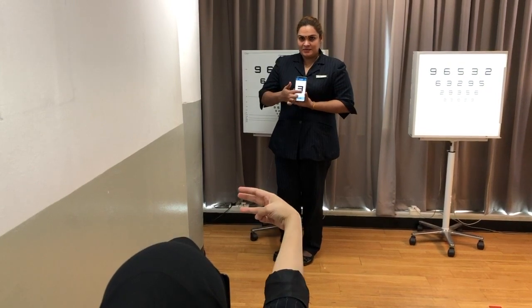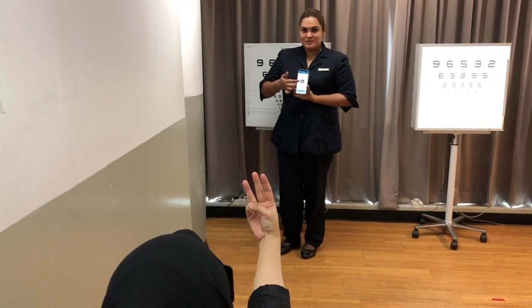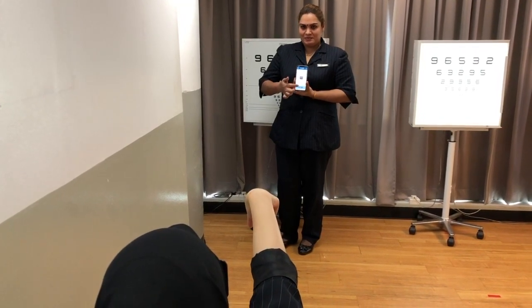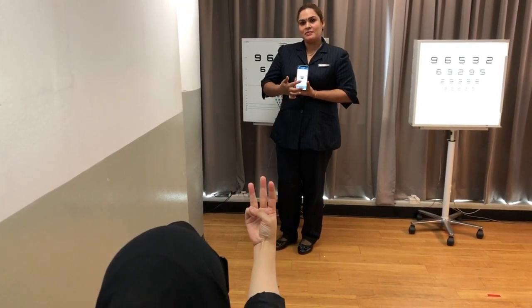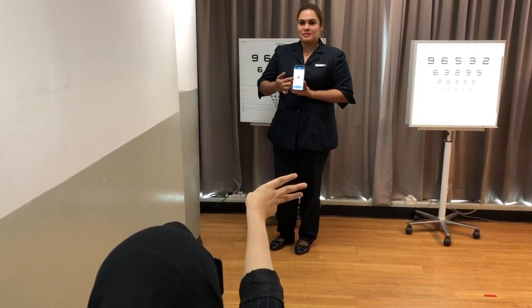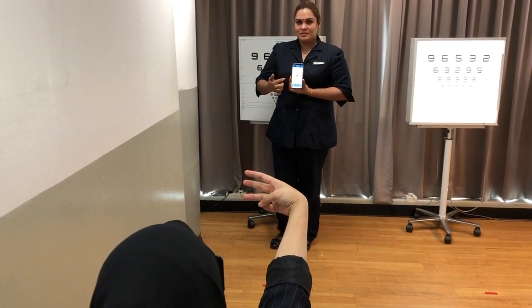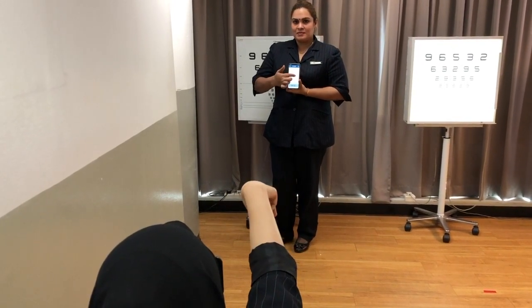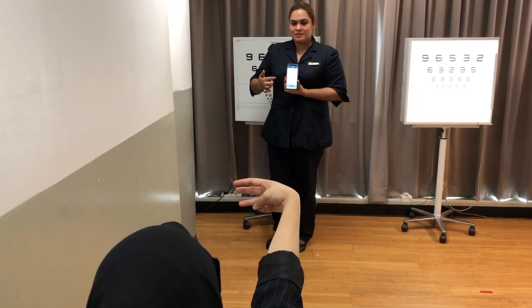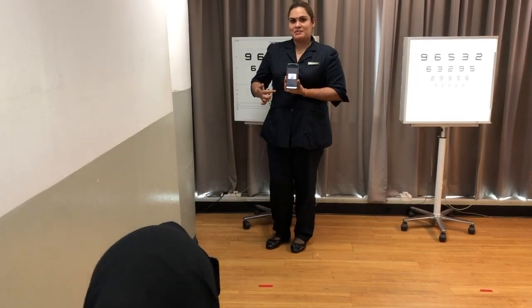The patient closes one eye and points towards the direction of E. The tester will be holding the phone, swiping towards the direction of the test subject. The tester does not need to look at the screen. This can be done even in a noisy place.